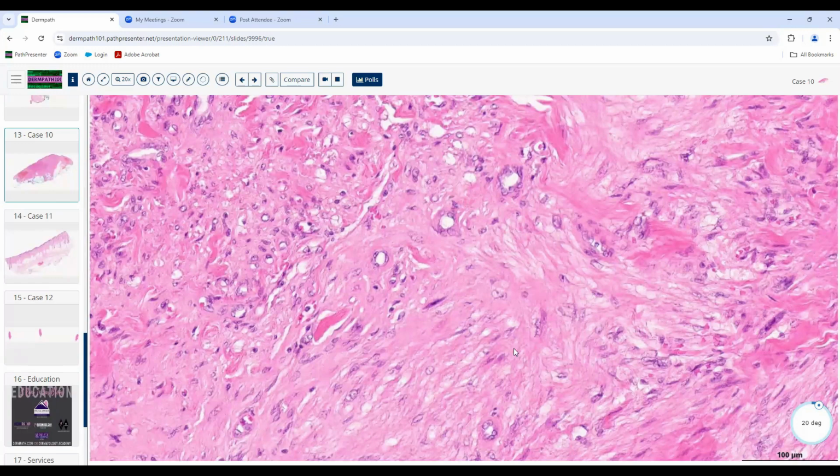If you look at the cytoplasm, for neural, sometimes it's delicate and may have a slightly mucinous character to it. If it's muscle, it generally tends to be pinker, like we see here. And if it's fibrohistiocytic, it may have very little cytoplasm, or it can be somewhat clear sometimes, like for a histiocyte, where you can get slightly clearish cytoplasm. So you use those features to help you. If you're not sure, then obviously we can resort to immunoperoxidase stains that can help between the three.